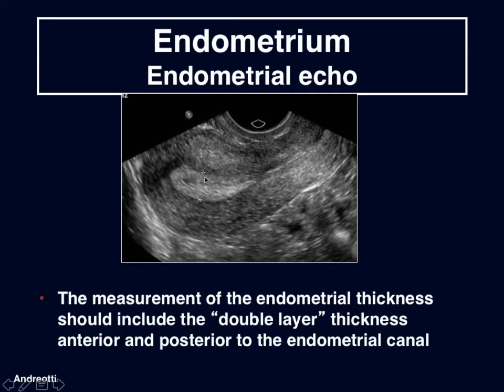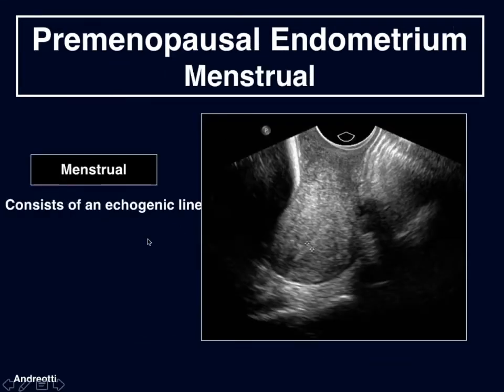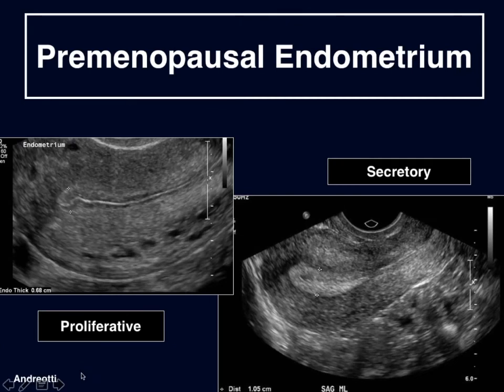Here we can see this endometrium — since it's completely echogenic, it is very easy to place our calipers on either side of what we call the endometrial echo. According to past reports, this should not exceed more than about 14 to 16 millimeters. Here we can see the very thin echogenic line at the time of menstruation, the proliferative endometrium in the first phase of the menstrual cycle which is predominantly hypoechoic around the cavity, and the secretory endometrium which fills in with echoes following ovulation.